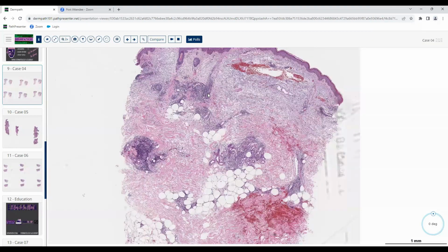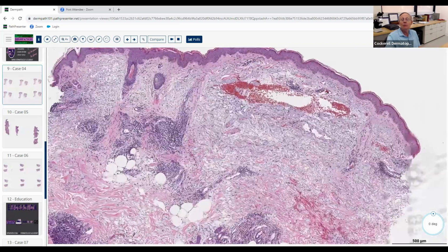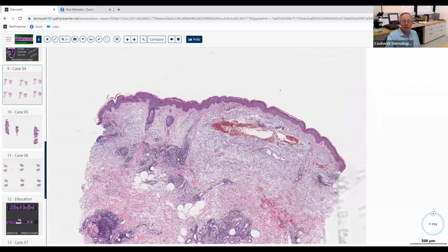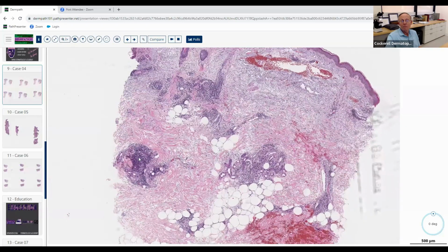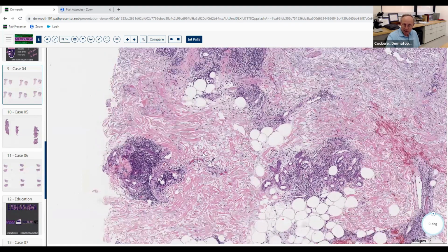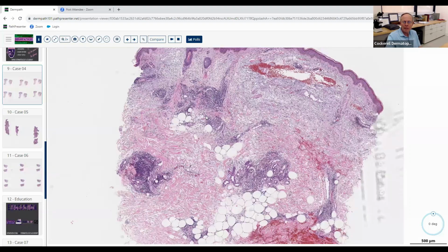Polymorphous light eruption. Good. That's the light part. And what do you see there that helps you make the diagnosis more specific, which we don't see here? Papillodermal edema. Excellent. Very, very good. What's another one? Leprosy. Leprosy can sometimes do it. Yes. Especially indeterminate Hansen's disease can sometimes give you a lymphocytic infiltrate. Yeah, that can do it.